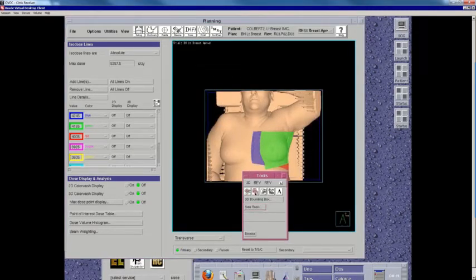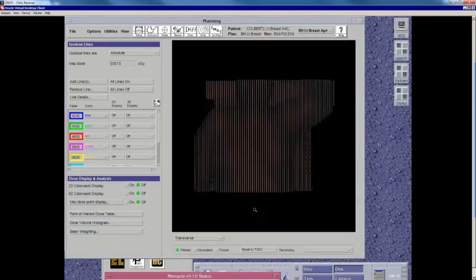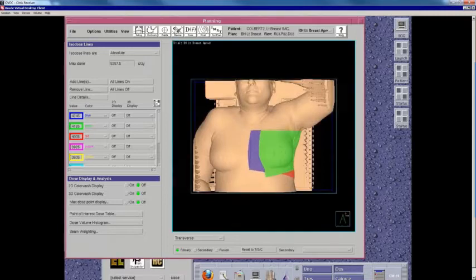So at MD Anderson, we typically set our patients up supine on a custom breastboard that we designed. It's basically just an angle board, and the patient lies on a vac lock on top of it. The vac lock is shaped like an L, so it can go underneath the patient's elbow and then underneath their torso as well. We suck the air out of it, and we most commonly set up patients with about a 10-degree slant on the angle board. That proves to be a very nice way to treat patients on a daily basis.